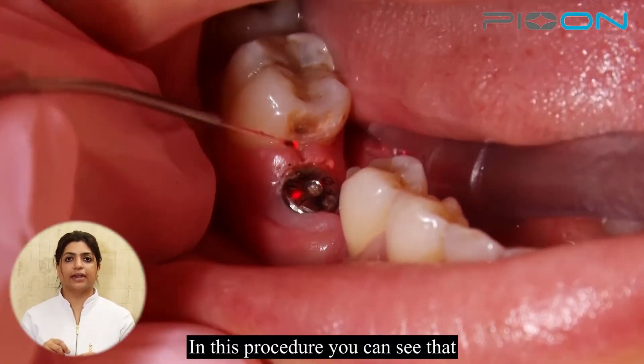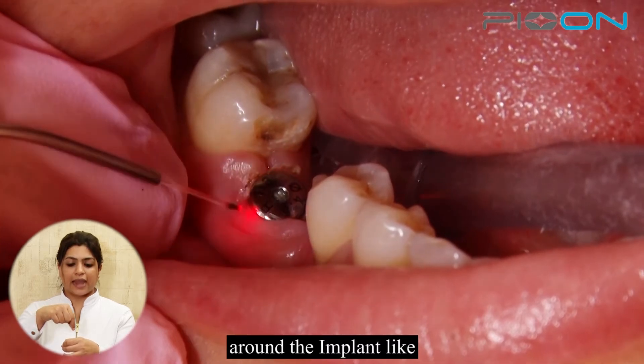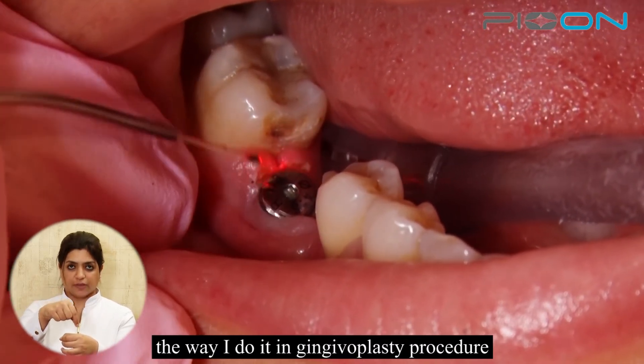In this procedure you can see that I'm gently moving my laser tip around the implant, similar to the way I do it in a gingivoplasty procedure.